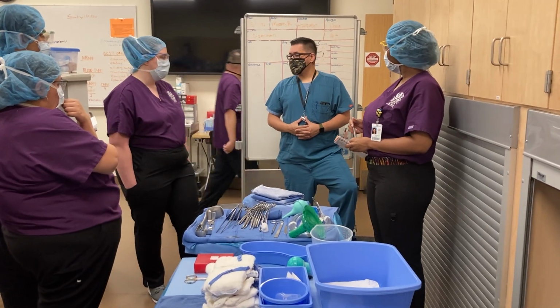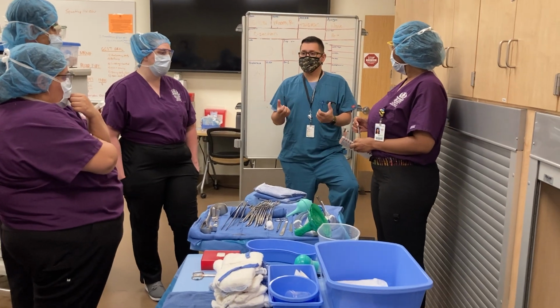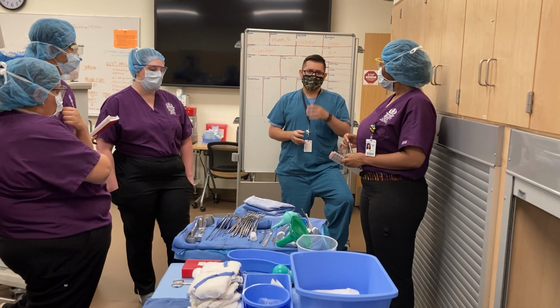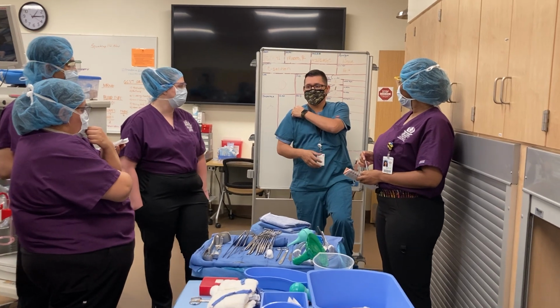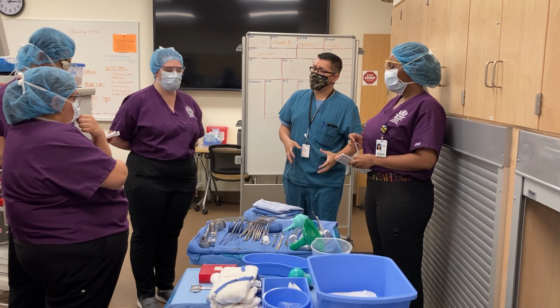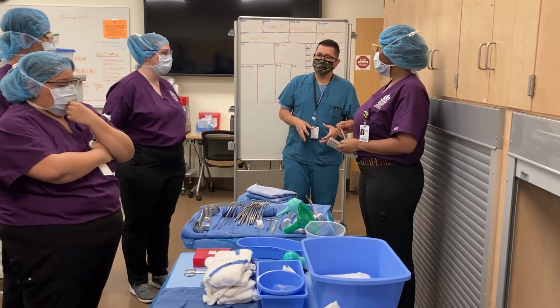If you saw the video, they use an Alexis retractor, which is a disposable rubber-type stretchy retractor. Really rare for them to use that, but it can be used because it stretches. You're not going to pull the baby out and there goes the shoulder on a metal piece, right, or the ear or foot or something. So we're not going to use the Balfour, but we're going to use something from it. Anybody have an idea?